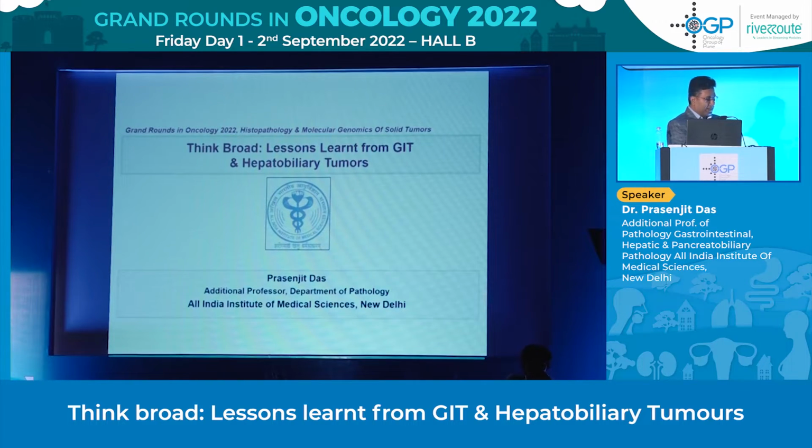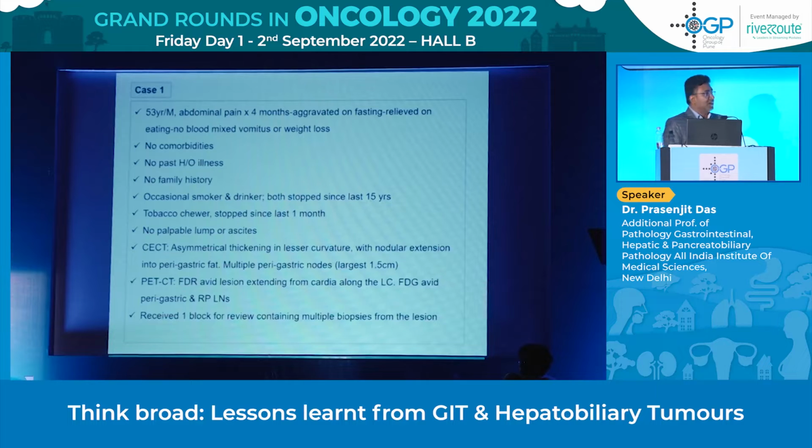So, my title is Think Broad and Lessons Learned from the GI tract and hepatobiliary tumors. I have picked up 4 cases from the last 2 months reporting where I really learned something. So I'll start with case 1.